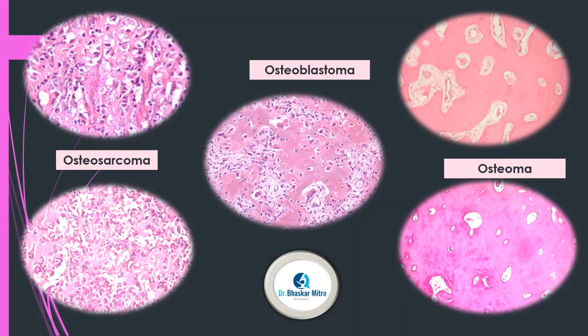So in the bone forming lesions on the benign counterpart, there are the osteomas where you can see the mature lamellar bone, the Haversian system, which I discussed very clearly in my first lecture. Then comes the malignant part. Here anybody can say this is a malignant lesion considering the cellularity and the cellular atypia, small and big cells along with lace-like osteogenic material or osteoid forming.